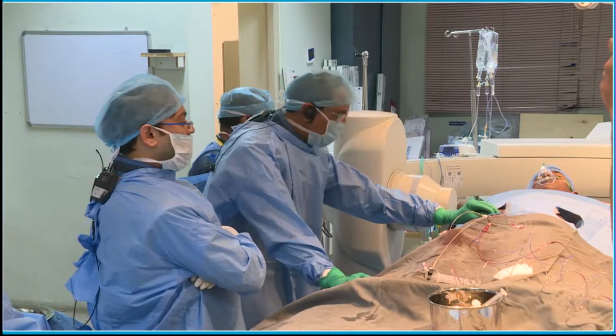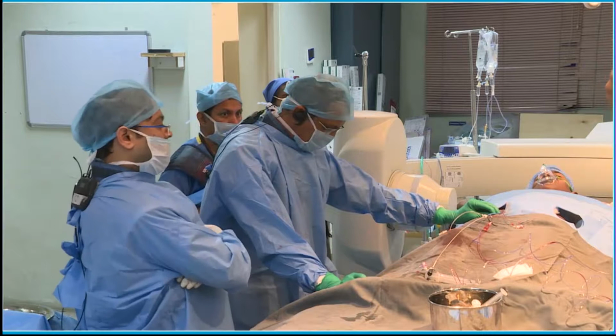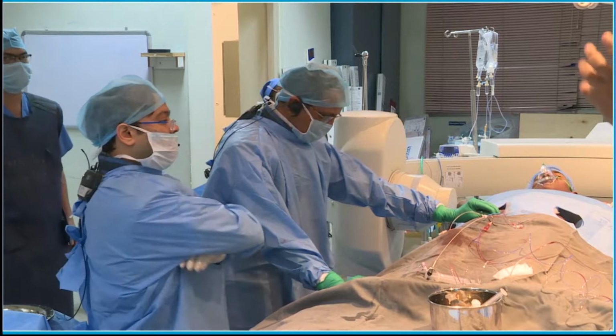counseling, I don't take the echo machine to the cath lab for PDA device closure. I deploy the device and do an immediate angiogram. As long as my position of the device is good, I release it. And I have counseled the families that most of the shunts will have some flow at the end of the procedure. When you come for the follow-up 4 to 6 weeks later, we'll show you that there will be no shunt. So that solves the problem, and they are also well aware that this is what is going to be the end result.